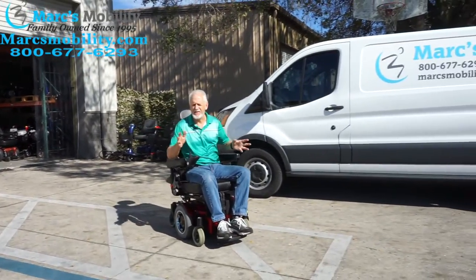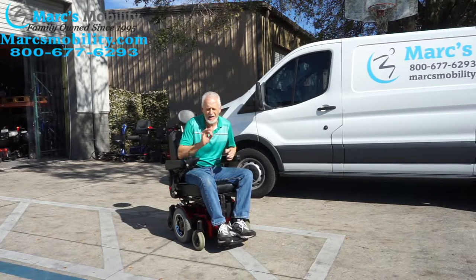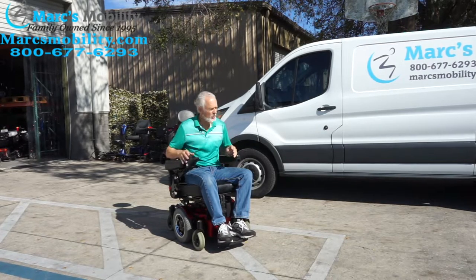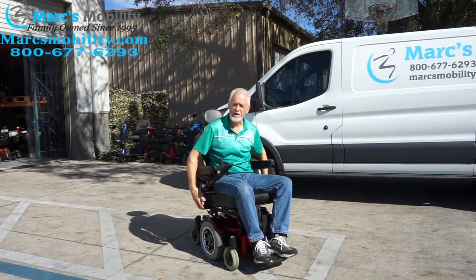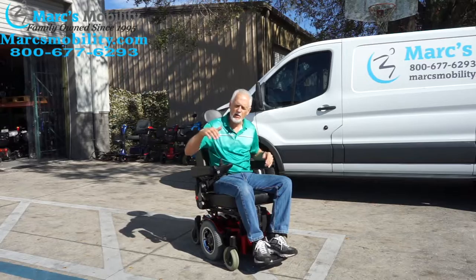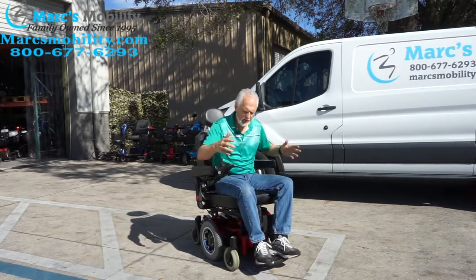This chair is going about six to six and a half miles per hour — it's supposed to go six miles but I think it goes a little faster. It's very responsive, and when you stop it stops within a couple of feet because it has electromagnetic brakes on the motor. Those brakes stop the chair even when going downhill or uphill.